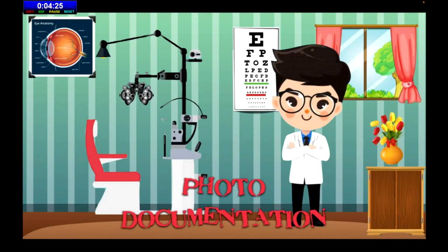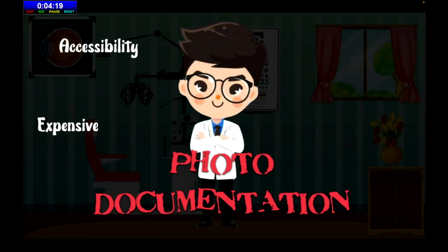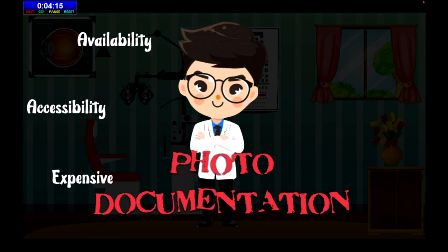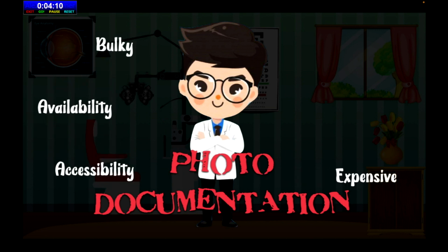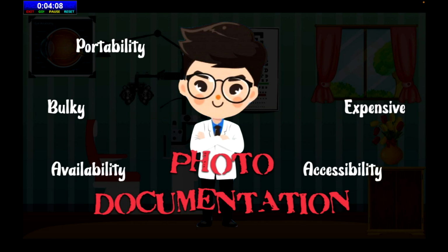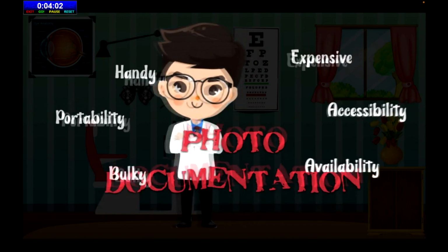But as you can see, most ophthalmologists in their clinics do not do photo documentation because they don't have the equipment for that, because it's expensive, accessibility is less, and the availability of these instruments is not possible every time in every place. It is very bulky, and the instruments cannot be transferred. Portability becomes an issue, especially in ICU patients, and these are also not very handy.